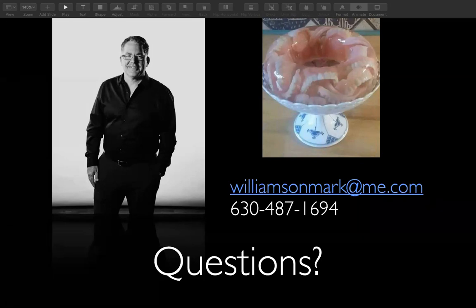Craig says, "Thanks, Mark. Great as always. Review the magic numbers again. 15, 30 to 35, etc." Yeah, so the restorative space for a typical All-on-4, you want 15 millimeters. Like I said, I measure from the crest of the ridge to where the occlusal plane or the incisal edges will be. That's kind of the magic number there. As far as implant torque, you want about 30 Newton centimeters when the doctor is inserting or placing the implant. They have to make sure they get at least that torque value. Sometimes it's higher, which is great, but if it spins, then no, you cannot do the conversion.